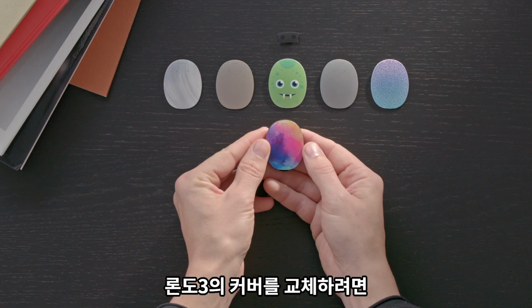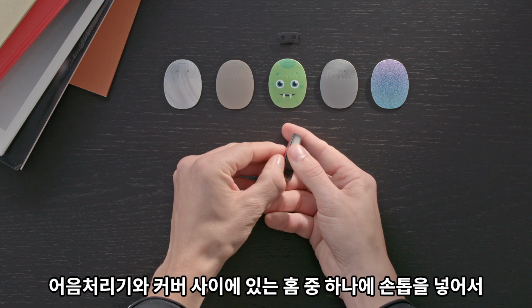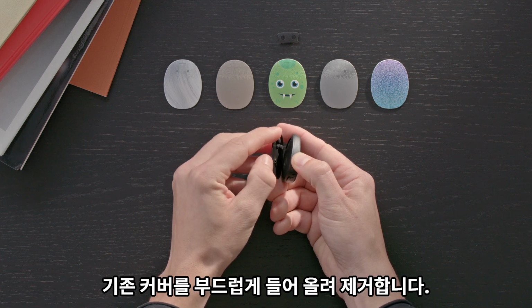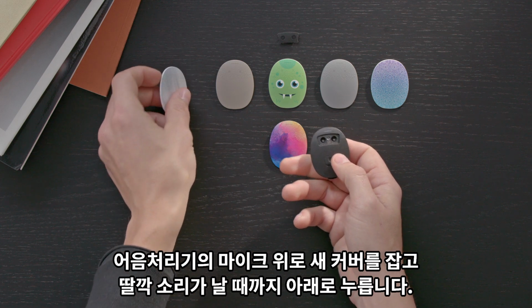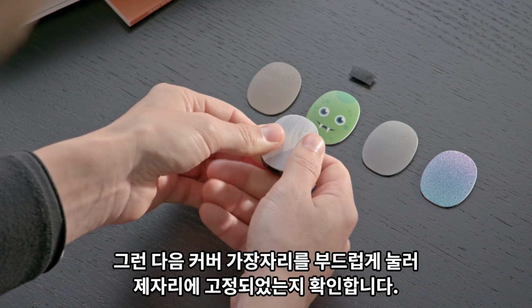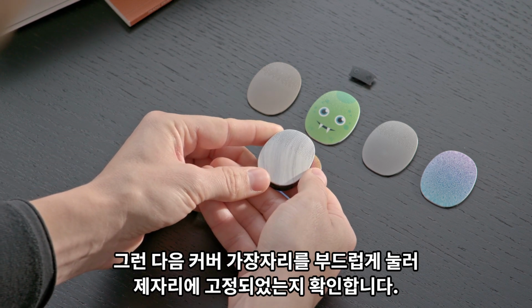To change Rondo3's cover, first insert your fingernail into one of the grooves on either side of the socket between the processor and the current cover. Then gently lift the cover up to remove it. Hold the new cover over the microphone openings of the processor and push down until it snaps into place. Then gently press down on the edges of the cover to ensure it has snapped into place.